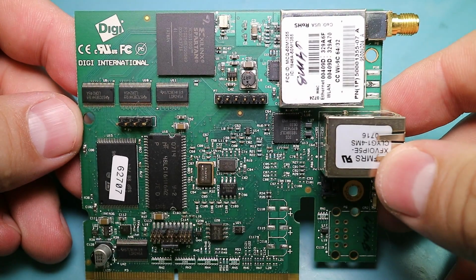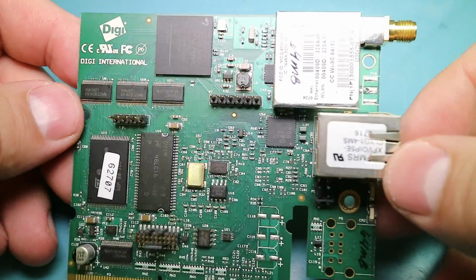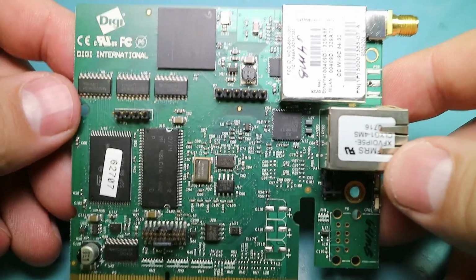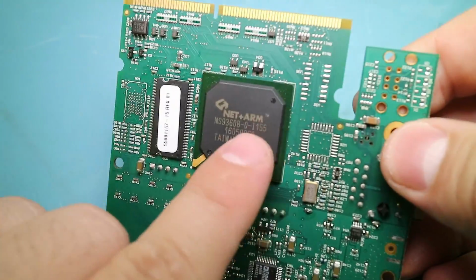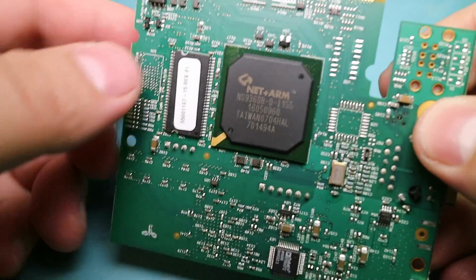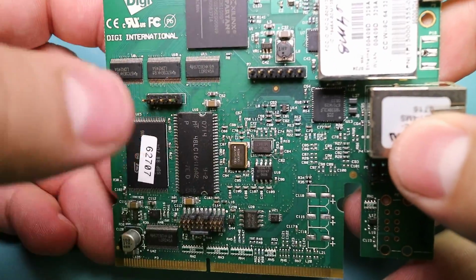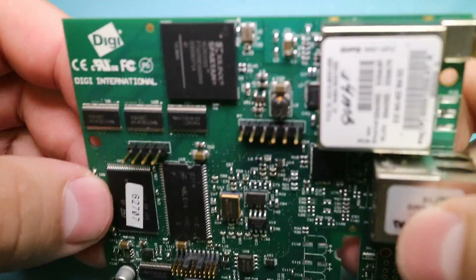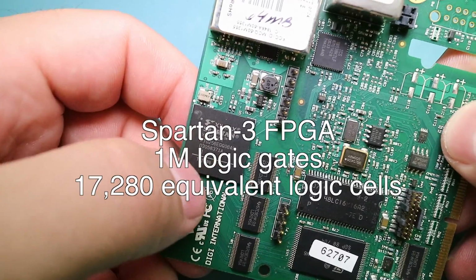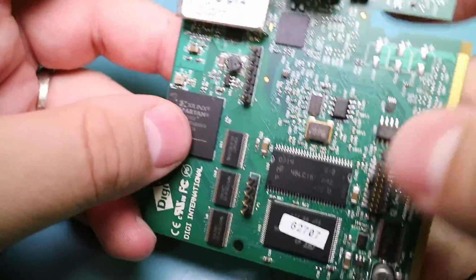The last piece is this Digi International ConnectCore 9C. I believe that's the right model. I had to do some Googling around. It seems to be just a system on module. It's got an ARM-based CPU, in this case, I believe running at 155 megahertz, and some memory, from what I can tell 256 megabytes. This particular one has a Xilinx Spartan. I'm not really sure what that's here for. It might just be available for people to use as part of the whole package.